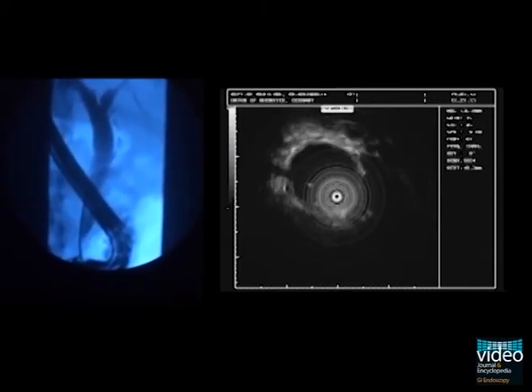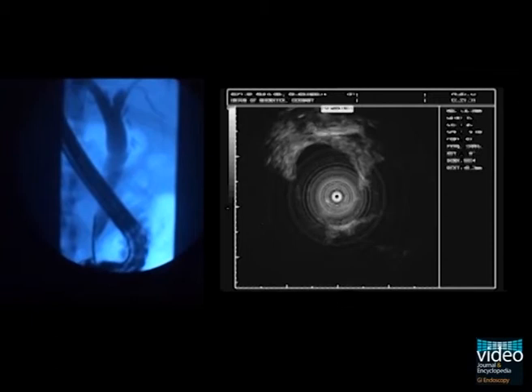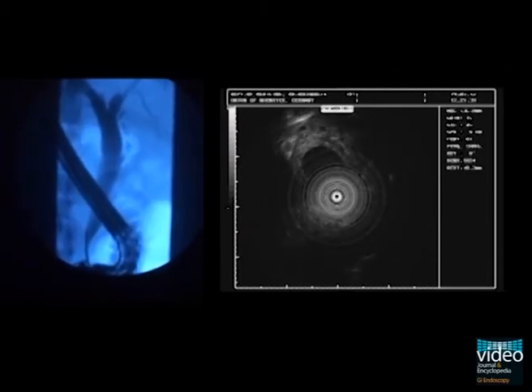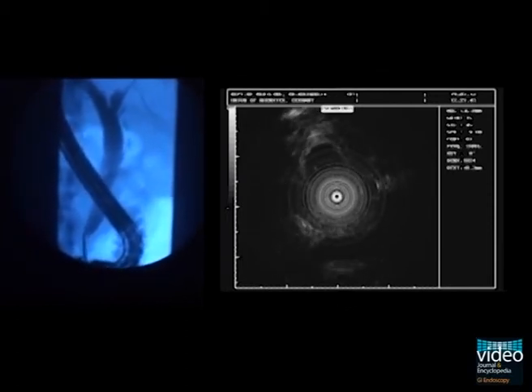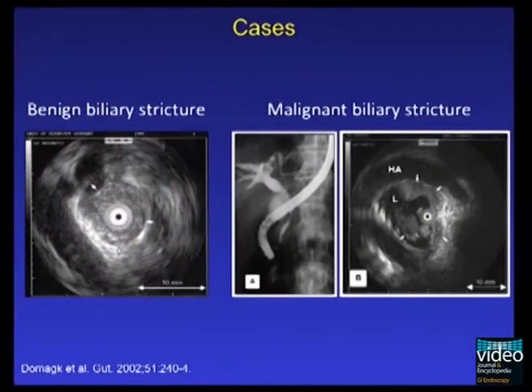In this case we observe a benign prepapillary stenosis in terms of a papillitis stenosis. Benign strictures are characterized by a homogeneous echoic mass with smooth margins, as seen on the left-hand side. On the right-hand side we see images of a patient with pancreatic cancer, where ERCP suggested a malignant biliary obstruction. IDUS showed an echo-poor mass infiltrating the common bile duct and being in close topographic relation to the hepatic artery.